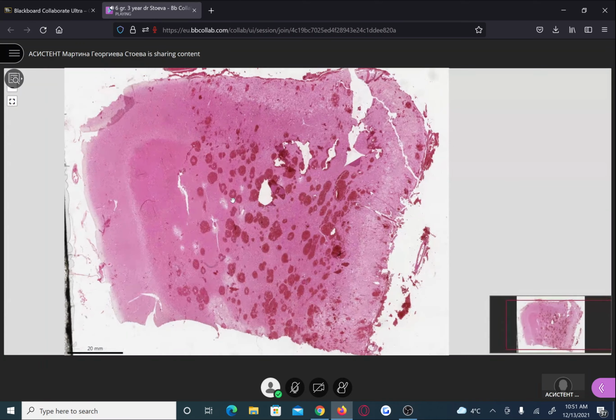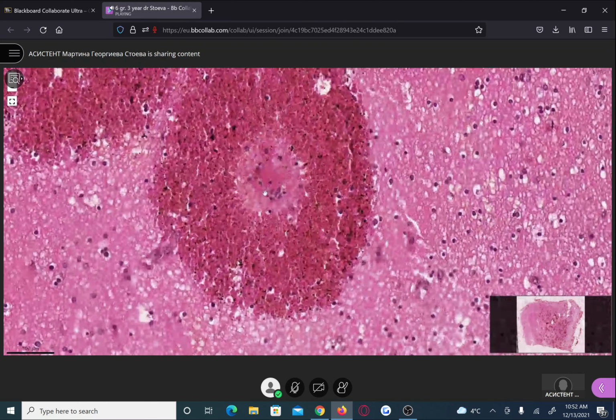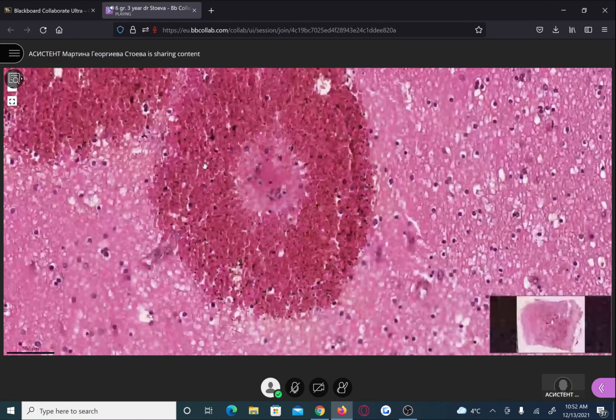In the middle, it's not exactly empty space. We can still find the lumen of the capillary, and here there are some erythrocytes as well. They are just more concentrated a little bit far away from the wall of the blood vessel. But here in the center, we have the still preserved capillary with the blood vessel wall, because it's not ruptured. It's only with increased permeability, and the erythrocytes move through the gaps between the endothelial cells, and then they go into the interstitium surrounding the blood vessel lumen.